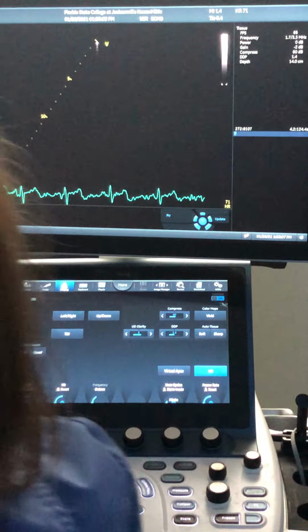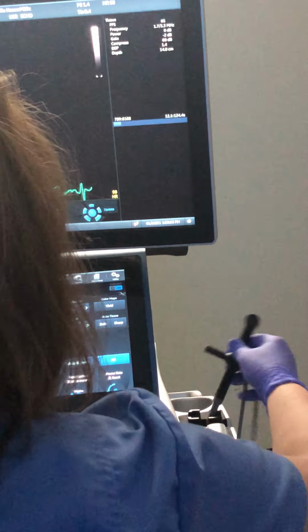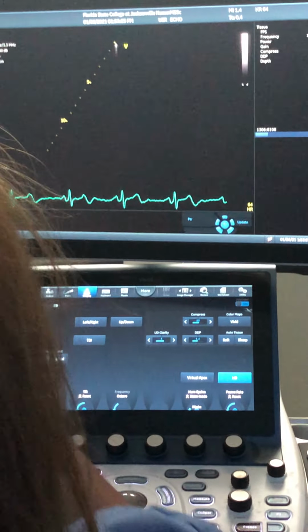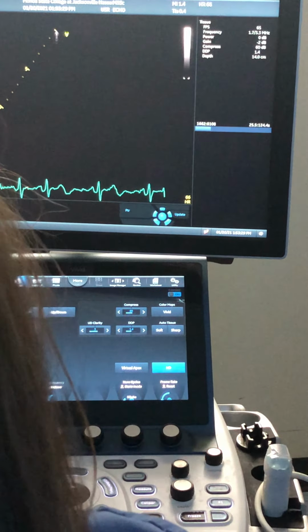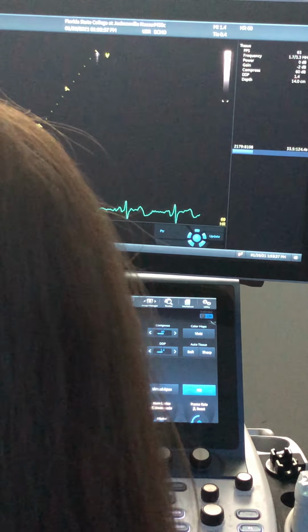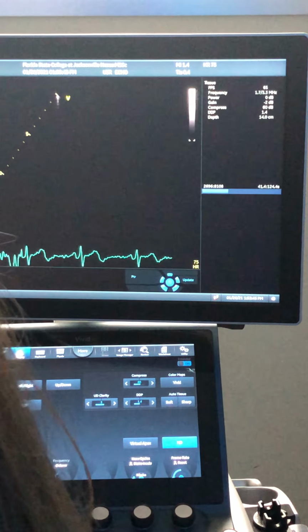All right, now with our Pedof probe. This is what we call our non-steerable or non-imaging probe. Turn it to the side there. This can be changed to whatever's comfortable for you, so you can move this up or down. I like it kind of here in the middle, because that's how I hold the probe, on this crossbar right here. Okay? All right, so this is how the sound beam is going.